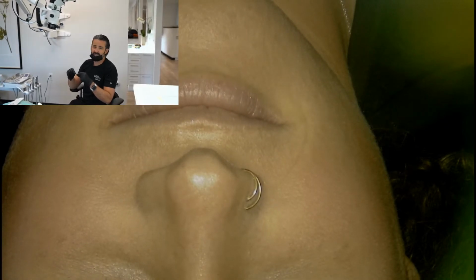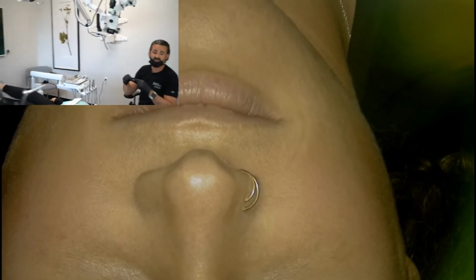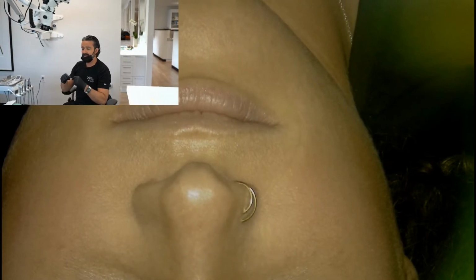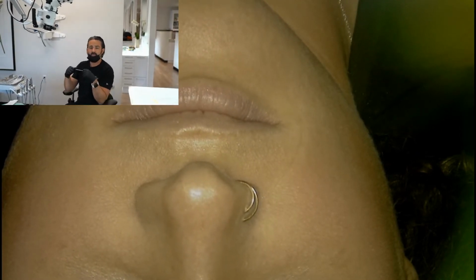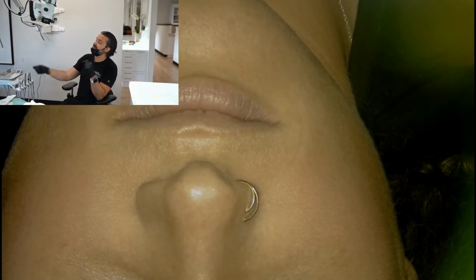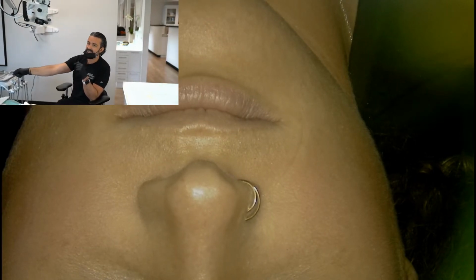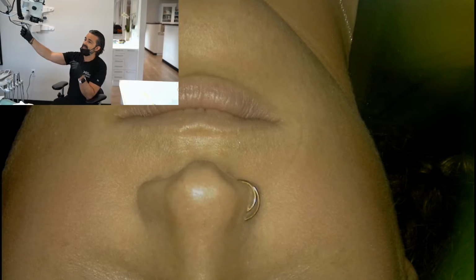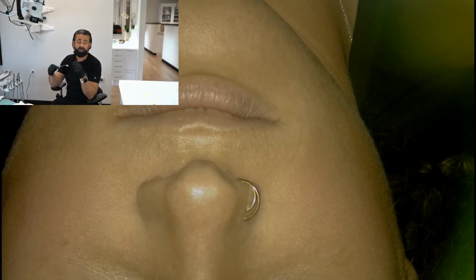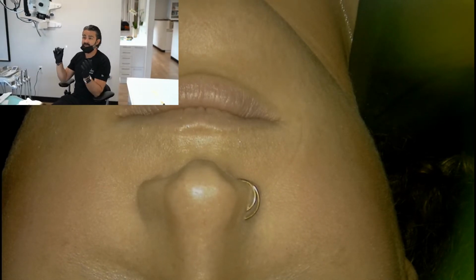I do have an associate that's coming in that's a left-handed doctor, and so we are actually flipping the rooms around specifically for him. But that's just something to think about. And that would be an argument, if I wanted an ambidextrous room, then naturally going where this light is, or off left or right off the patient's knee spot, is a great place to go in the ceiling, because that can still work for both a left and a right-handed doctor. And 12 o'clock can work that way. It's just getting used to sort of an arm over your shoulder.